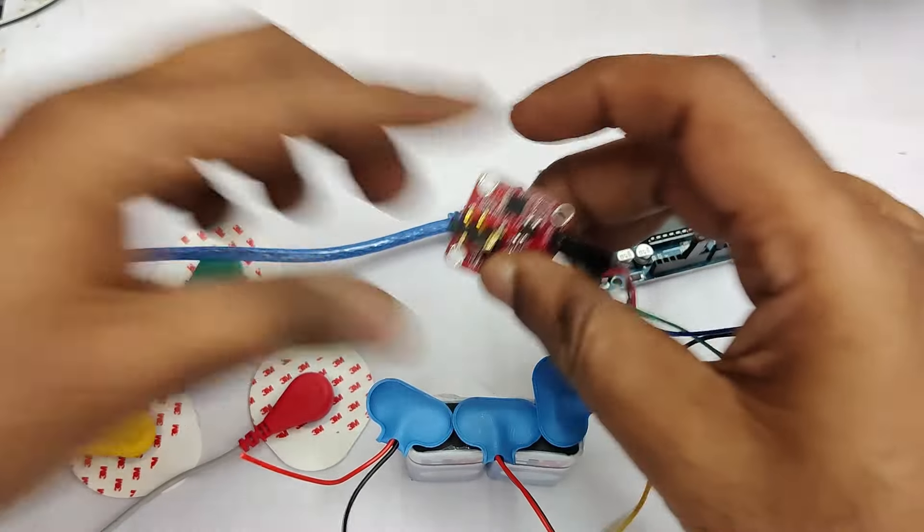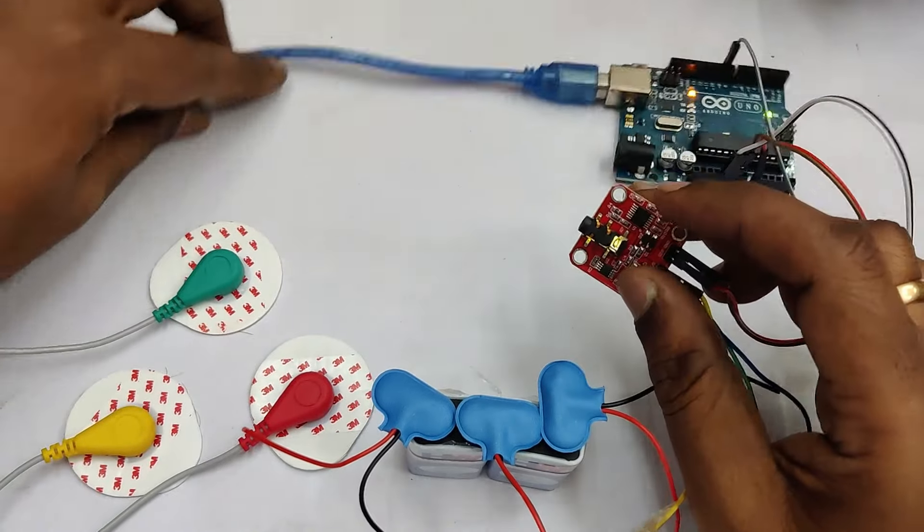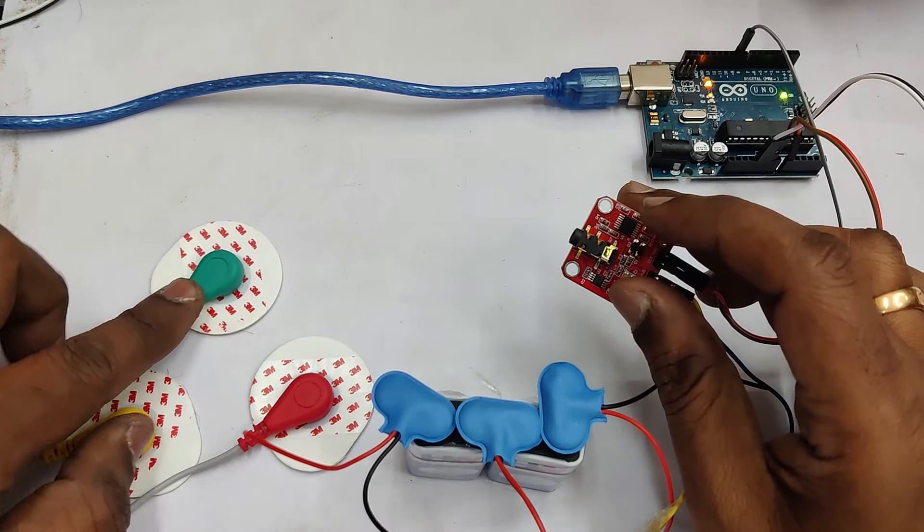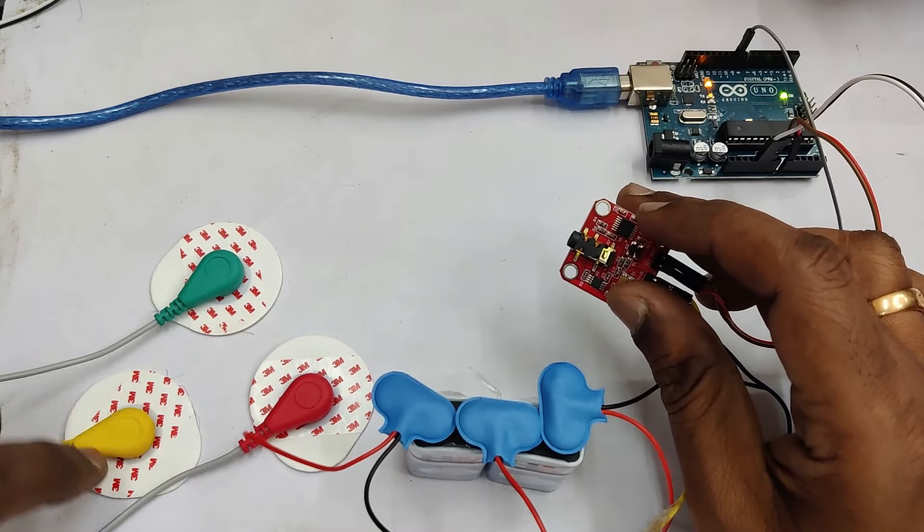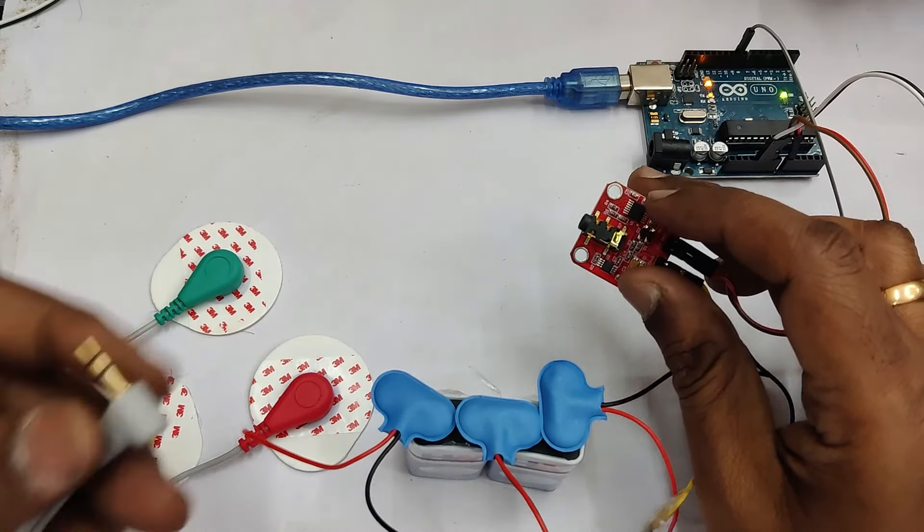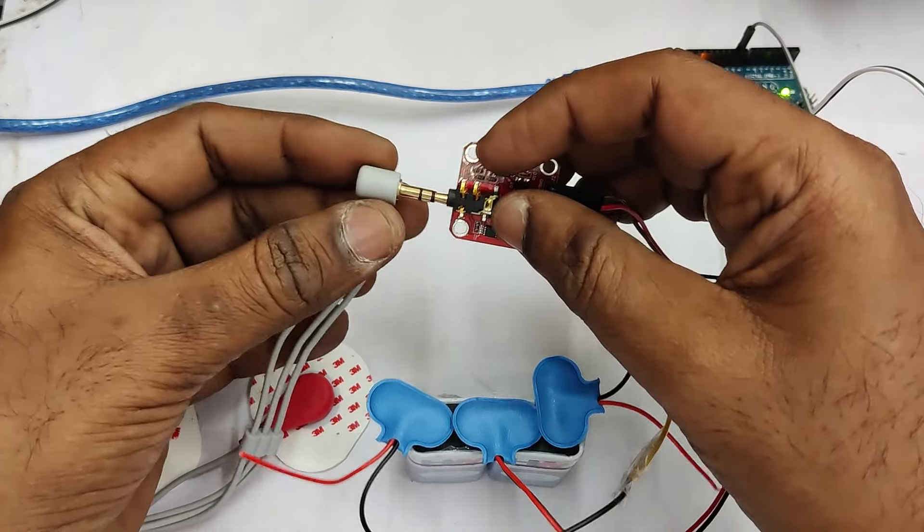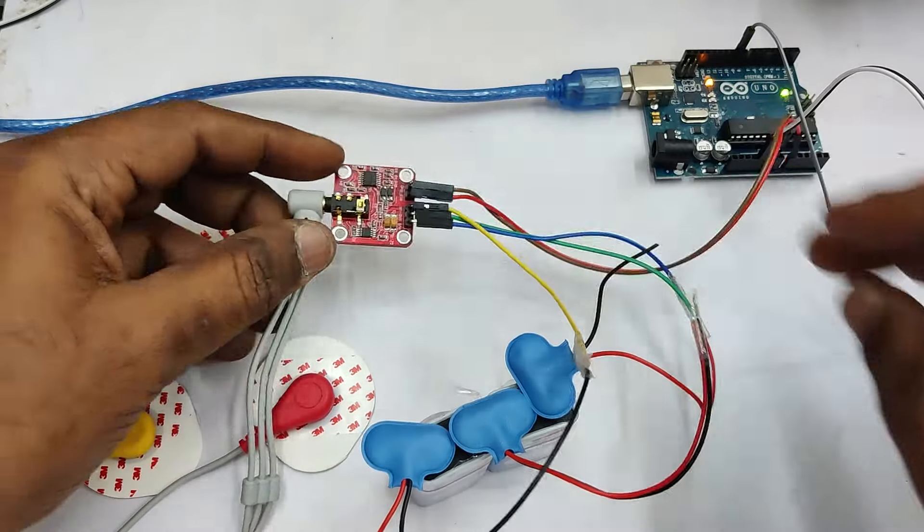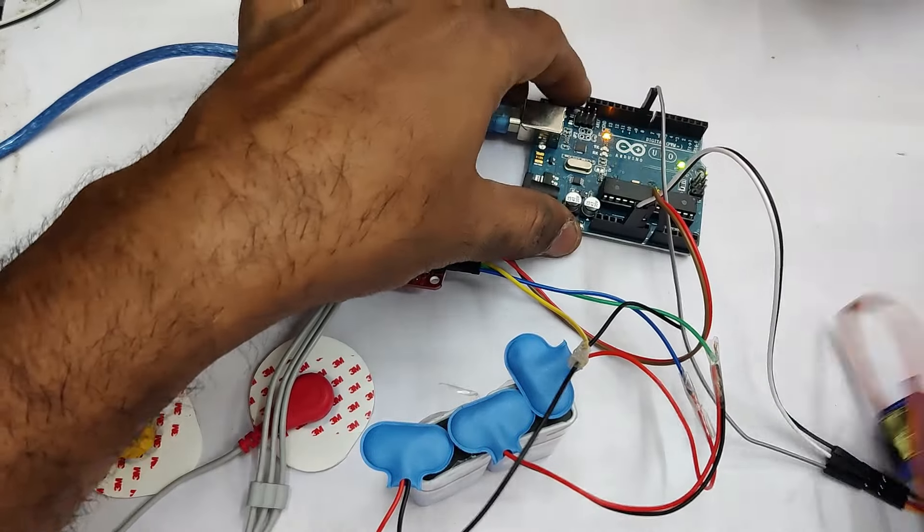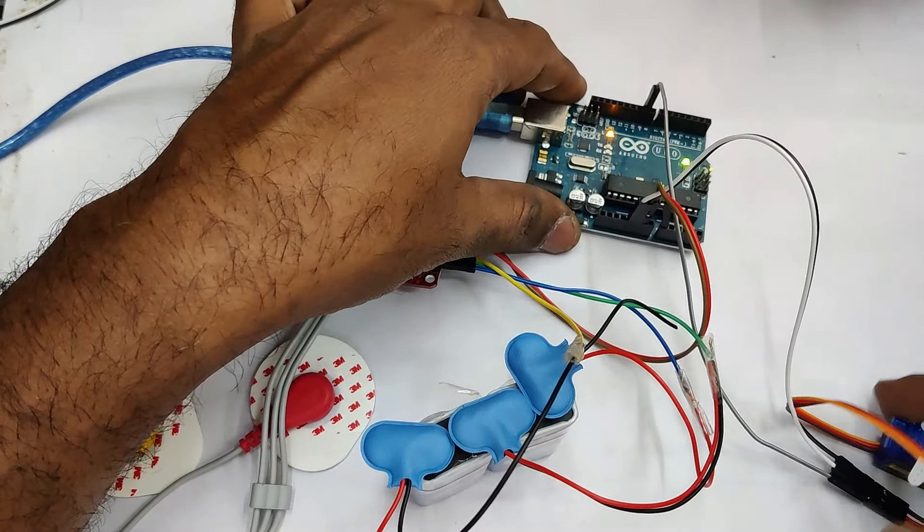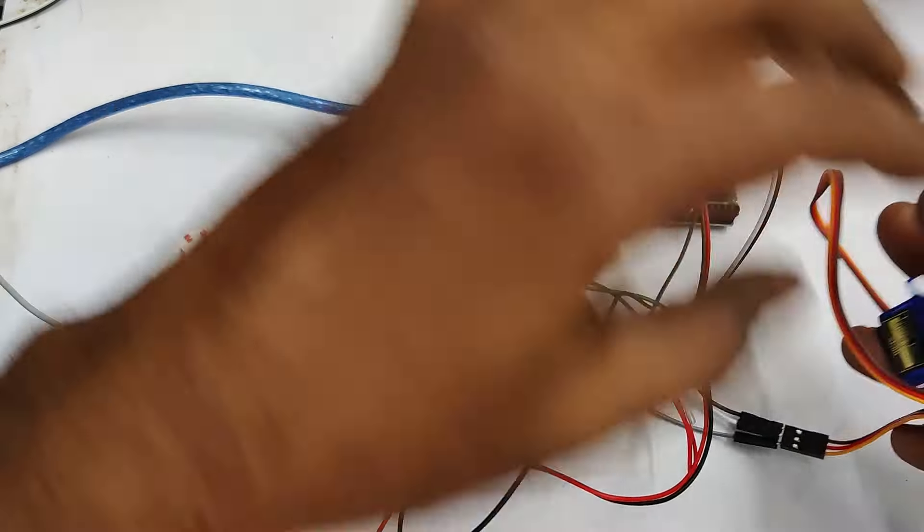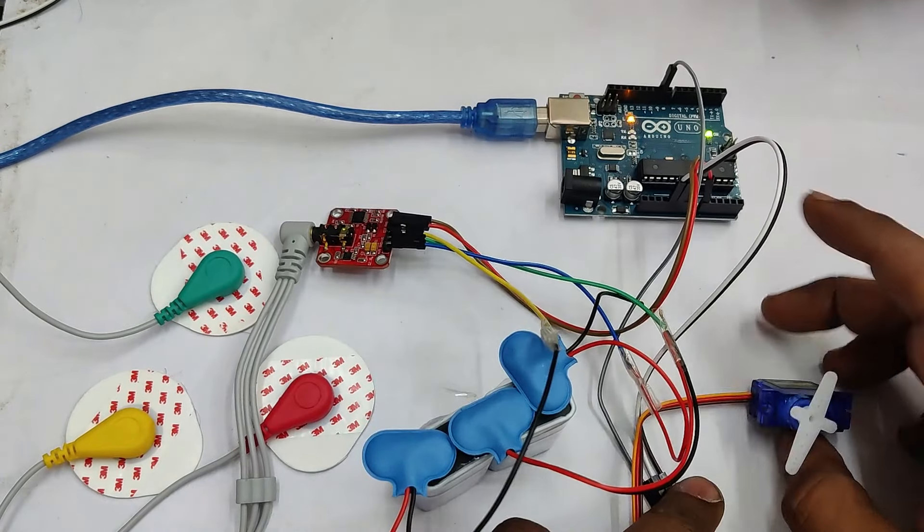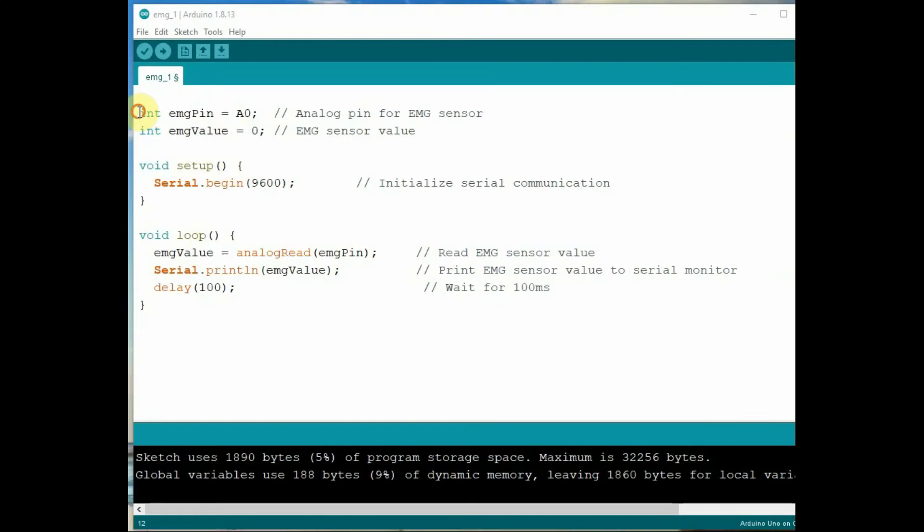Now we have got the three electrodes, that is a green, red and yellow electrodes. The 3.5mm jack can be connected to the EMG PCB. And if you want you can connect a servo to digital pin 9.